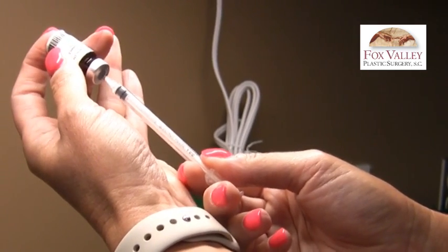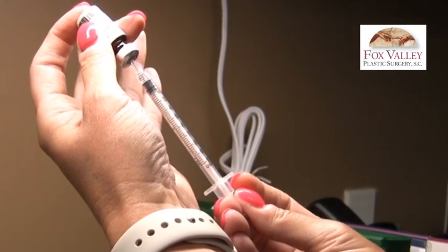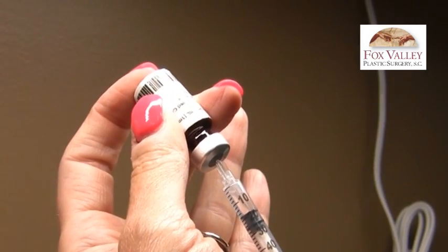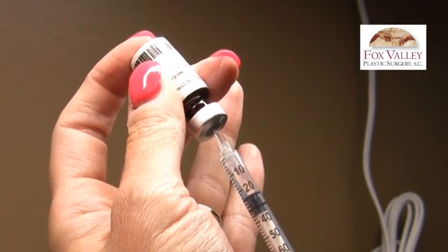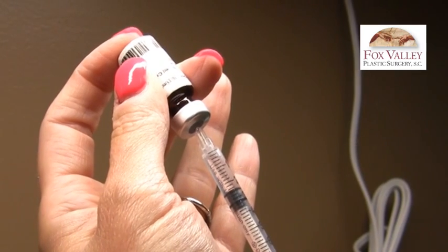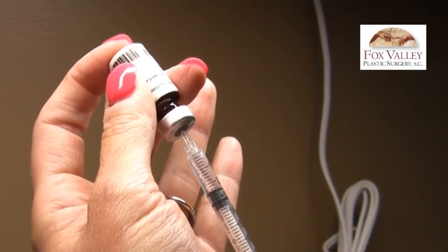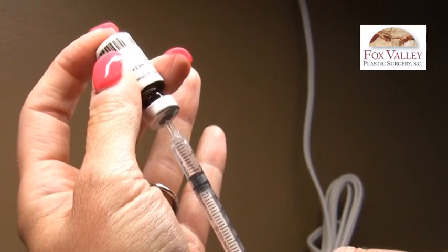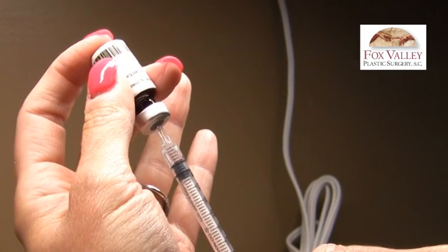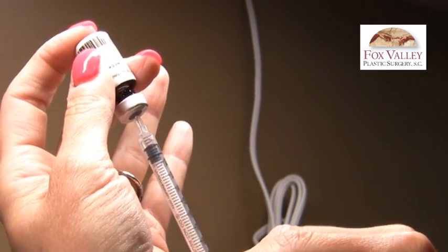Put the needle in and slowly pull back the medication. You may or may not see an air bubble forming in the top of the syringe — air bubbles are normal. Pull back more than you need. We're starting everyone at six units of medication, which on this 100-unit syringe is the third line. Gently push up on the plunger — the air may or may not go back into the vial — stopping at 10, then 8, and that is the 6-unit mark.